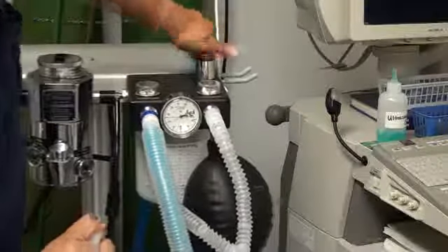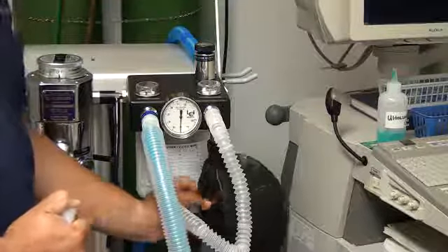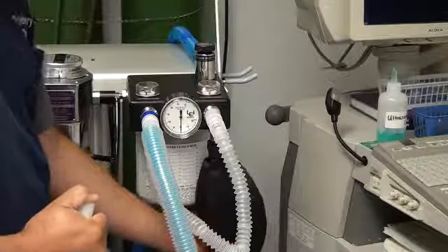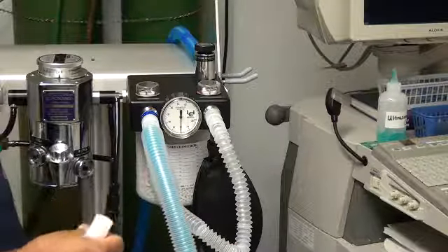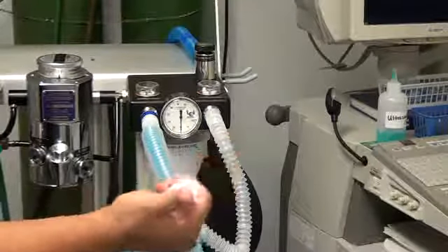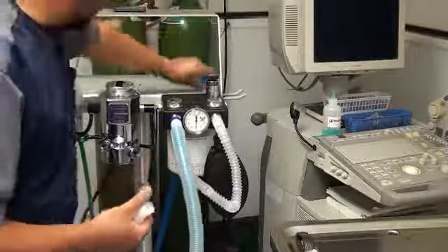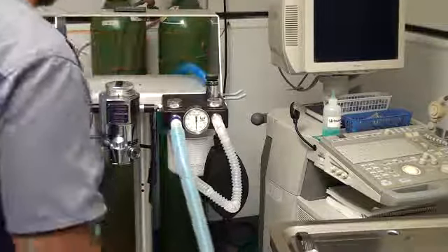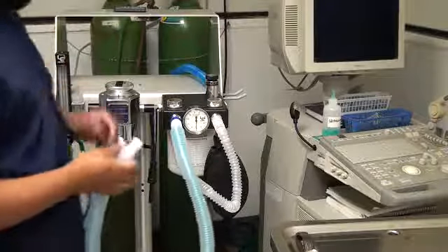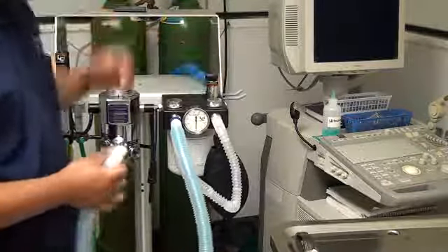I'm going to release the pop-off valve, and the manometer drops down, and the reservoir bag completely deflates. Once this is done, I can release my thumb off the tubing. And at this point, I would check the scavenging system to make sure that all the connections are in place. Everything is hooked up. Nothing was blown off by the pressure. And we can now make sure the pop-off valve is completely open.